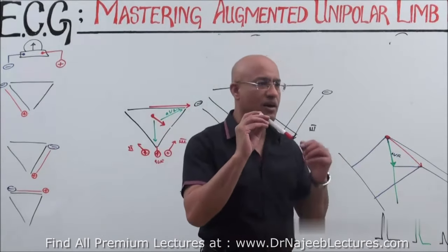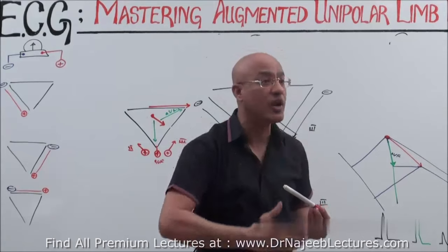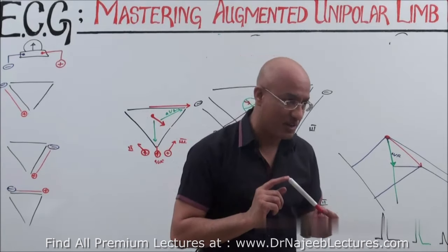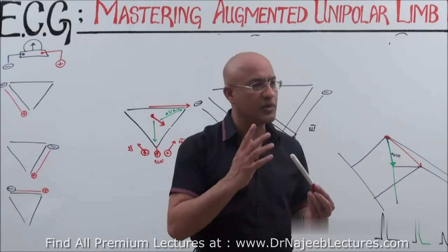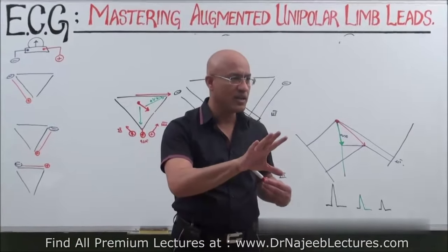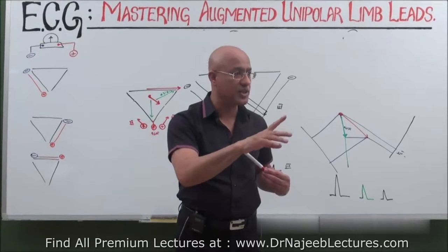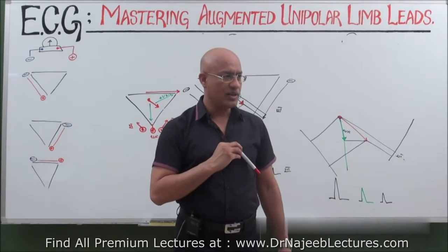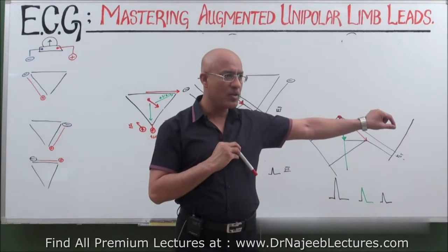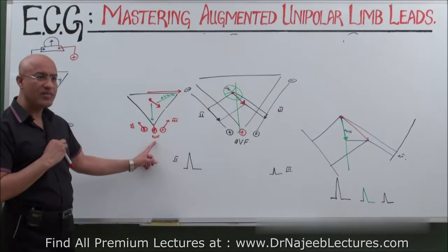So what is the orientation of the electrical vector of major ventricular depolarization in the frontal plane? The question is, what is the orientation of the mean QRS vector in the frontal plane? We say the orientation is downward and leftward, or around 60 degrees usually. Later on we'll have a very big lecture about the axis, the normal electrical axis of the heart and axis deviation. But for a while, we just assume it is 60 degrees. So any lead which has its positive or exploring electrode down or left, the deflection will be positive. The inferior leads are lead 2, lead 3 and the perfectly inferior AVF.